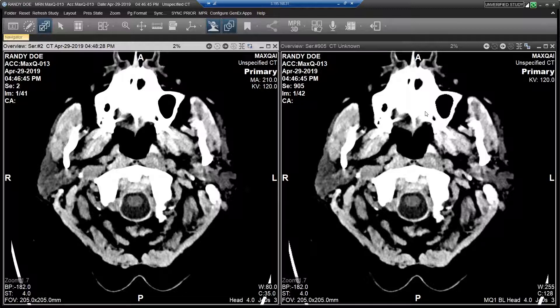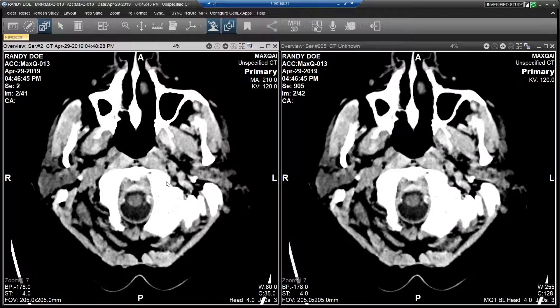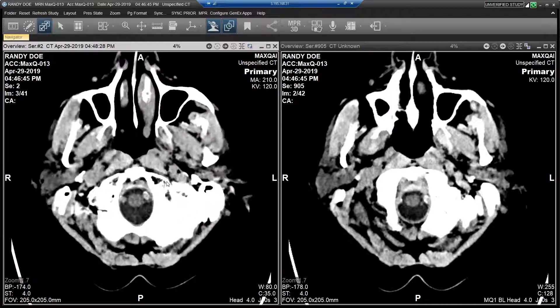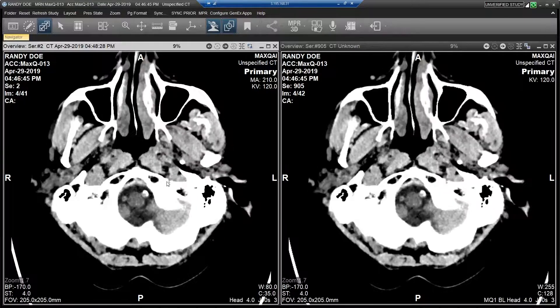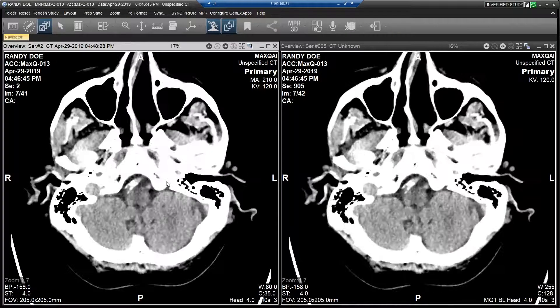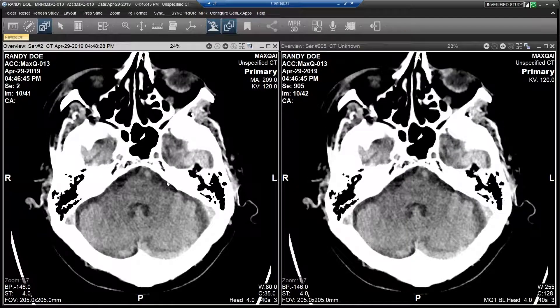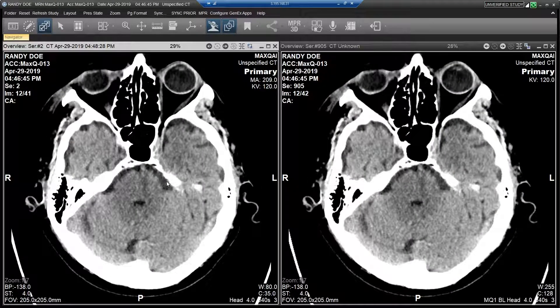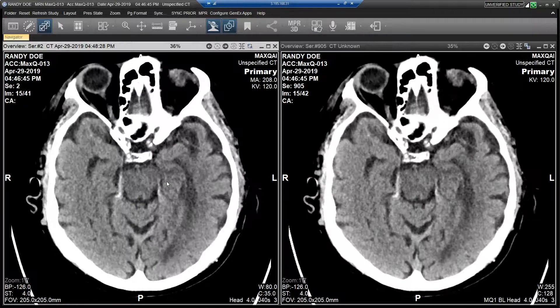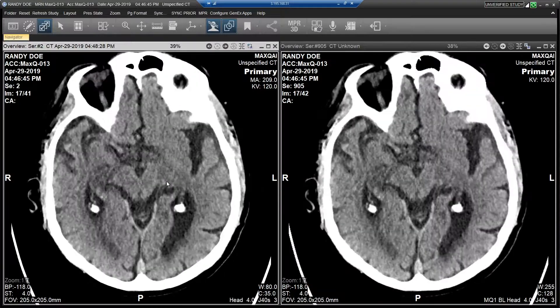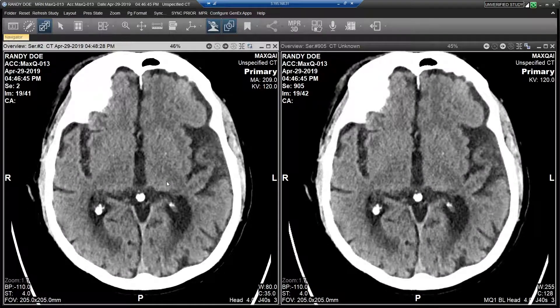The AI results can be automatically incorporated into the hanging or step protocols. This allows the AI results to be shown along with the current study. In this example, we are seeing the primary study on the left. A DICOM secondary capture series produced by the AI algorithm is automatically hung for me on the right.